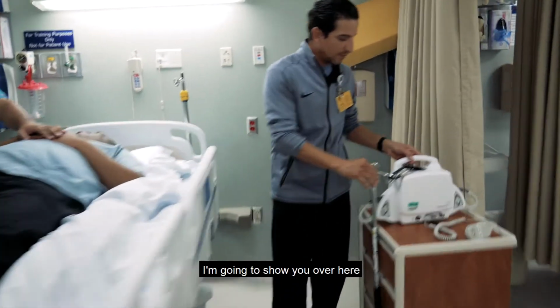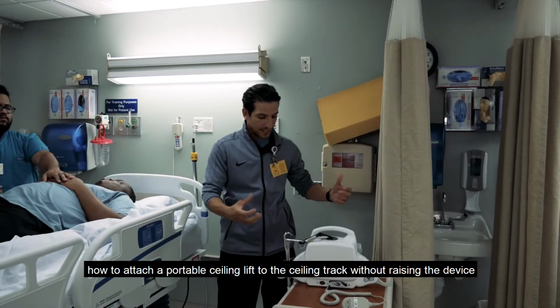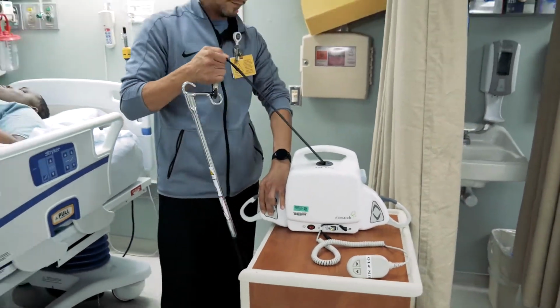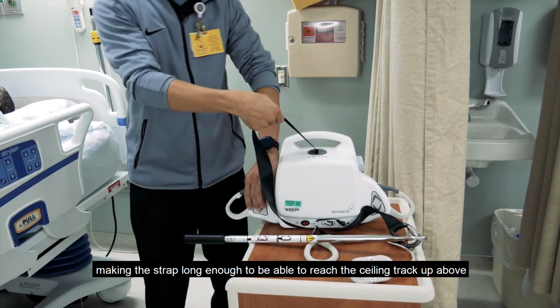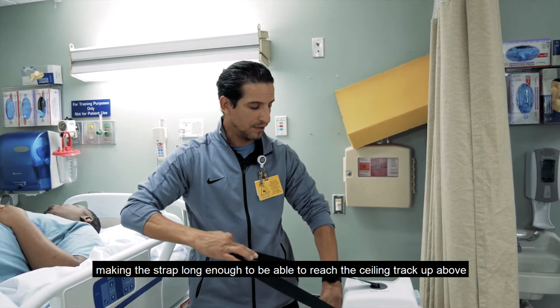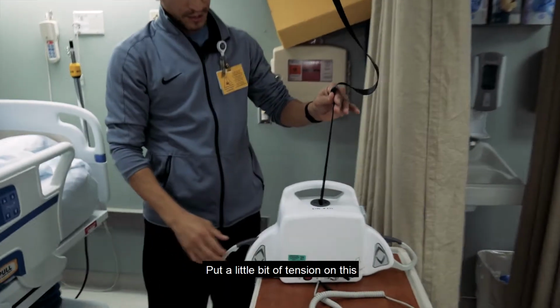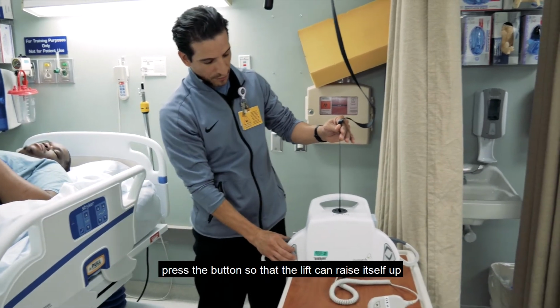I'm going to show you over here how to attach a portable ceiling lift to the ceiling track without raising the device. Okay, so I have the power on here. We're going to put a little tension on this strap here. So what we are doing is making the strap long enough to be able to reach the ceiling track up above. So now we have the slack that we need to attach it without lifting the ceiling lift. We'll put a little bit of tension on this, and now what we're going to do is press the button so that the lift can raise itself up.